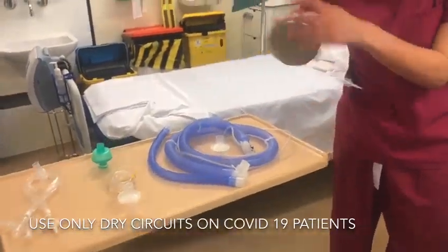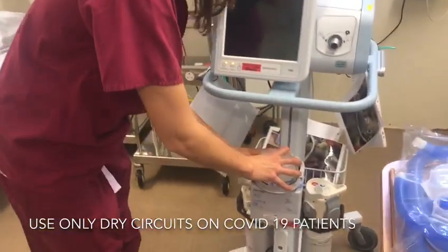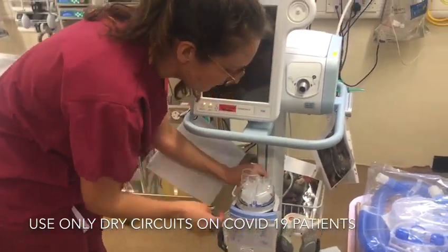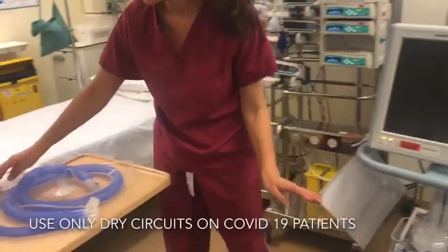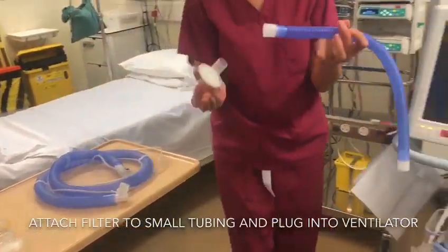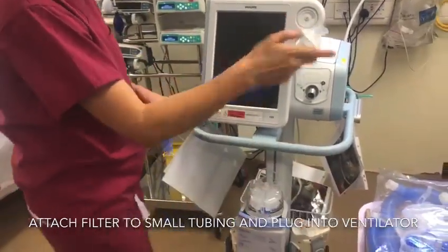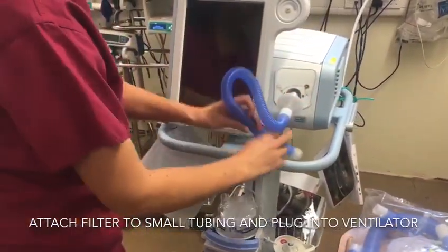Okay. First of all, we set up the Fisher-Paykel. We will not be using the Fisher-Paykel. For COVID-19 patients, we've been advised against wet circuits. We then start with a tubing, the small piece. This filter is in this set and it goes to the machine.